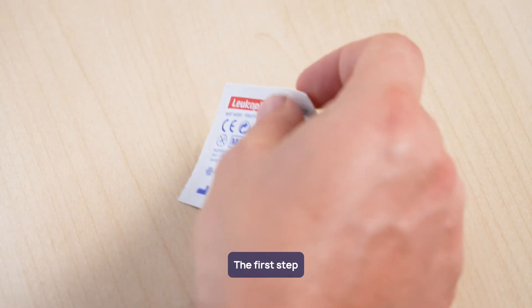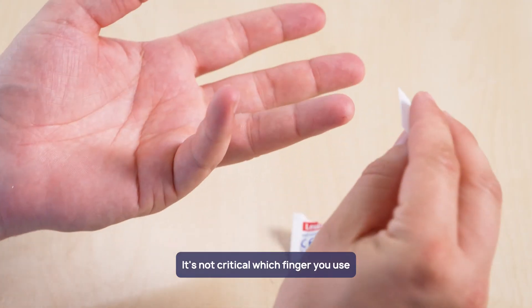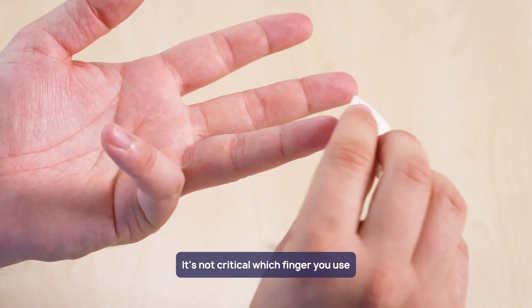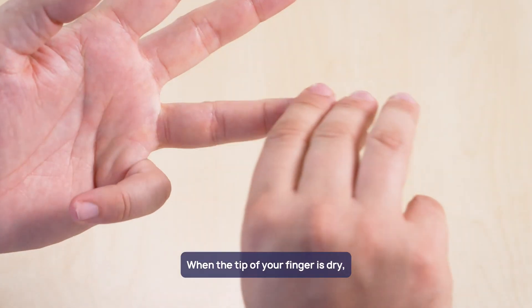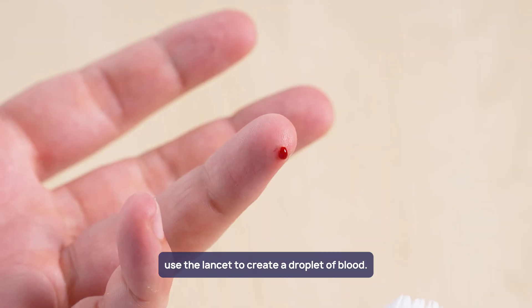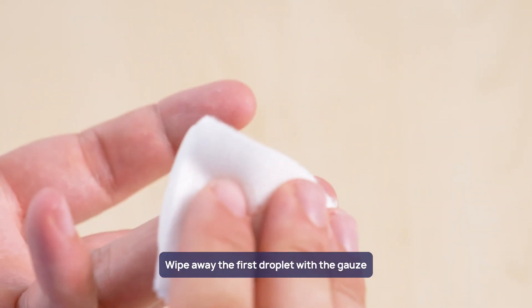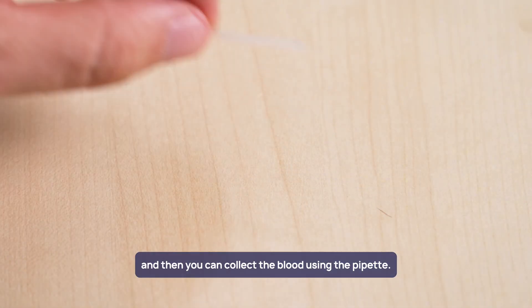The first step is to clean the tip of your finger with the alcohol wipe. It's not critical which finger you use, but the ring finger on the non-dominant hand is a popular choice. When the tip of your finger is dry, use the lancet to create a droplet of blood. Wipe away the first droplet with the gauze, and then collect the blood using the pipette.